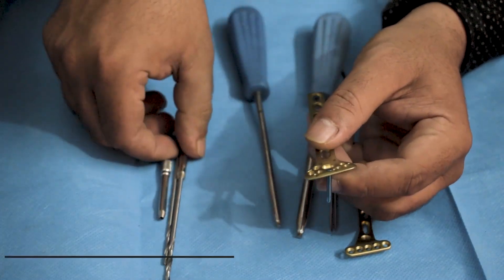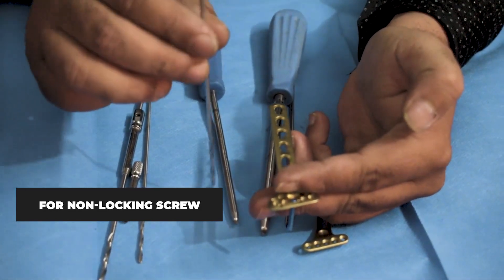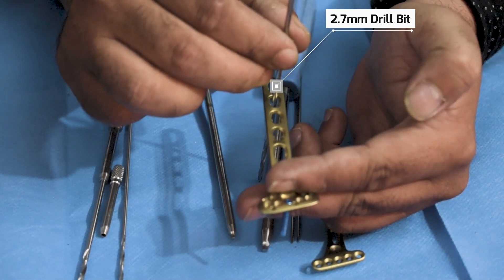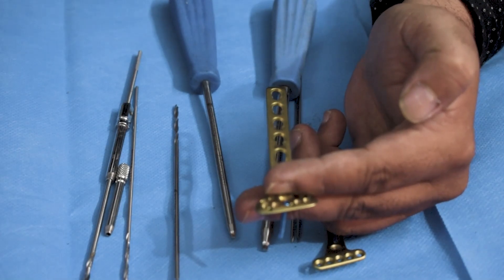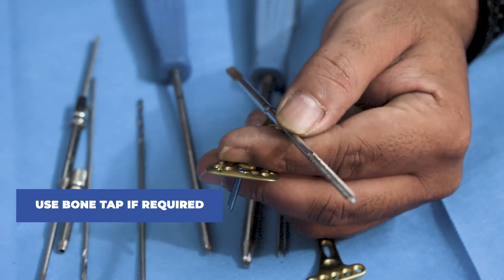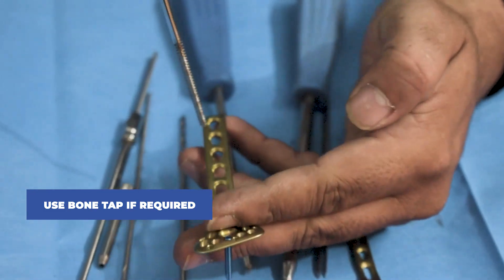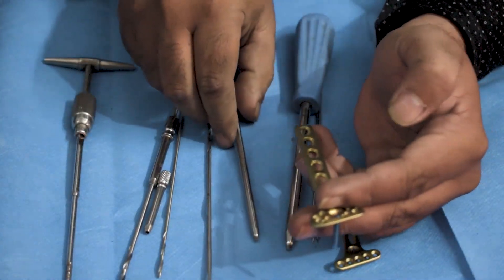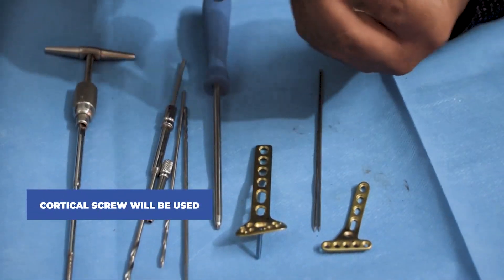To fix a non-locking screw in the shaft of this plate, a 2.7mm drill bit will be used for the drilling. After the drilling is done, one can use a bone tap to tap for smoother entry of the screw. After tapping, a cortical screw is used in the shaft region of the plate.